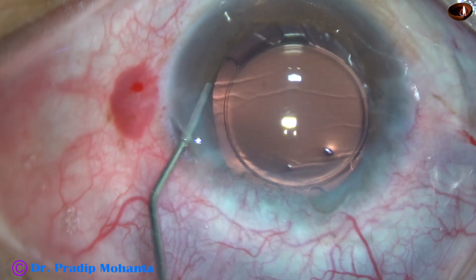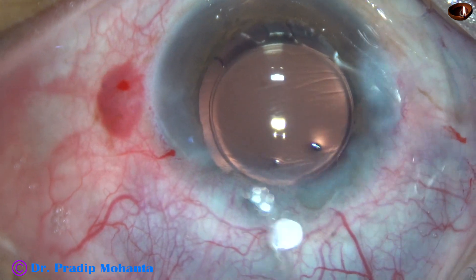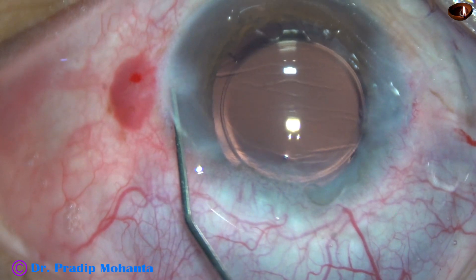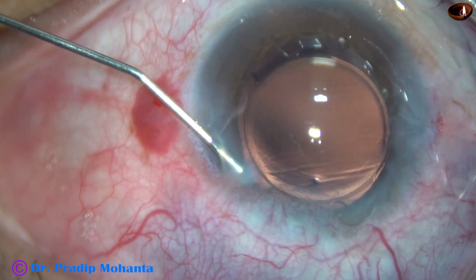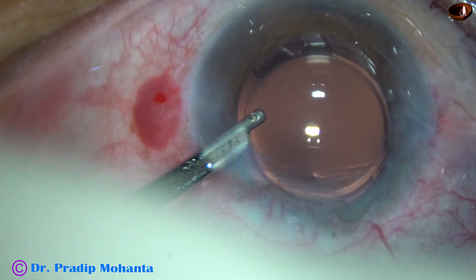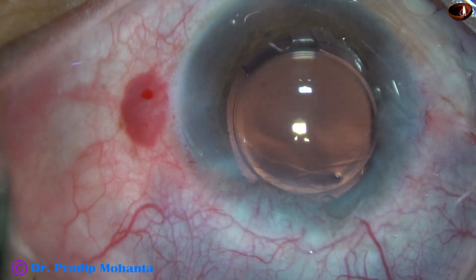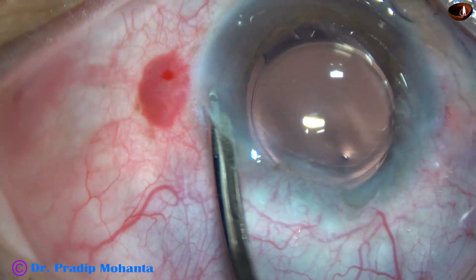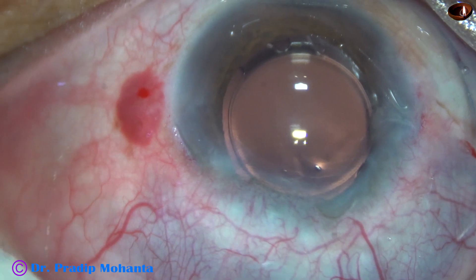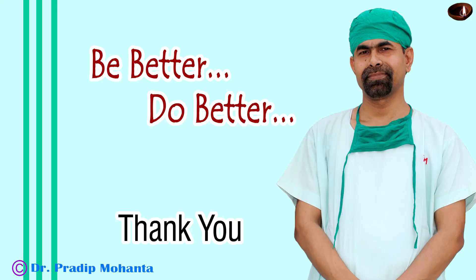Now a bit of moxifloxacin is instilled. The single side port made in this case is being closed by hydrating the corneal stroma on the other side. The main wound has also been hydrated. This is the final lavage of the anterior chamber — at this time any viscoelastic sticking to the corneal endothelium comes out. The anterior chamber is very nicely formed, the intraocular pressure is kept on the higher side, integrity of all wounds is checked, a few drops of moxifloxacin are applied over the cornea, and the case is concluded.